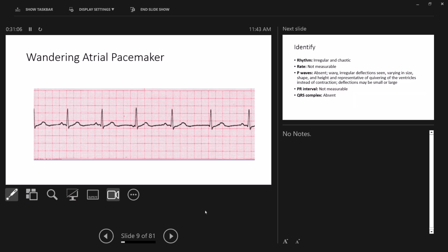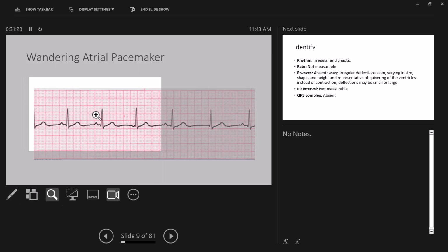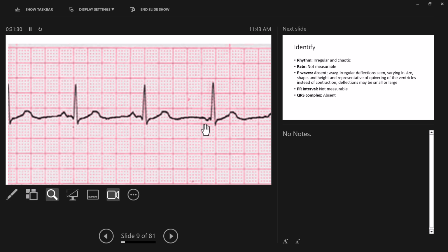So what is wandering atrial pacemaker? Tell me, somebody tell me what's happening with WAP? There's different pacemaker sites in the atria, firing at different times. So let me ask you a question then. Why do we have this guy right here? Is that coming from the atria? Ooh, you guys are good.